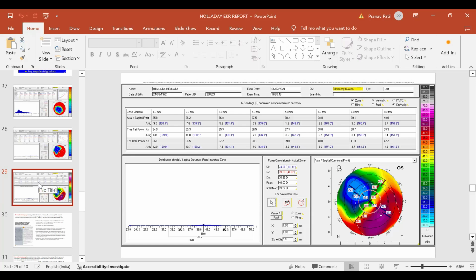See, the preoperative autoref is impacted not just by RK and the astigmatism and everything, but also by the cataract, so it won't be accurate at all. It's only in the post-operative period that the autoref may be accurate to some extent, but maybe retinoscopy might be the best way to assess that, and that's how I would want to assess post-op. The pre-op, I don't think has any value whatsoever. Okay, sir. Got it, sir.